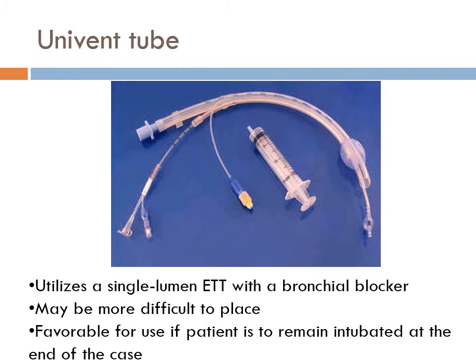All right, and then here, this cap. Once this is in the right position, you want it to stay, so you lock it down like this, and then notice as you pass it around, it doesn't move. If you're no longer one lung ventilating because this has moved, maybe it's position, whatever it is. If I extend my neck, does my tube go deeper or further away? And if I chin down, do I go deeper or further away? Because neck position actually does change the placement of the tube. So head extension, deeper or shallower? Shallower. Flexion, deeper.